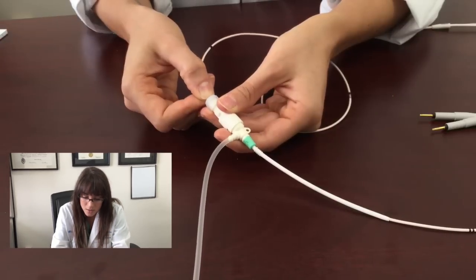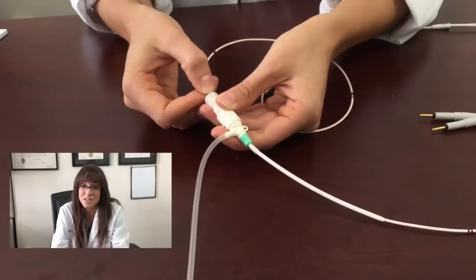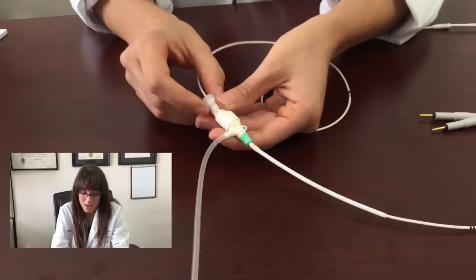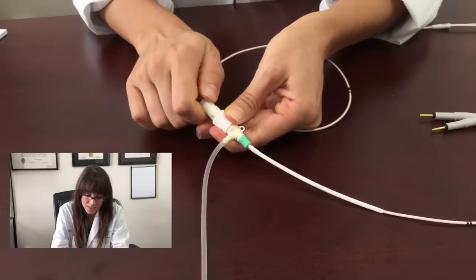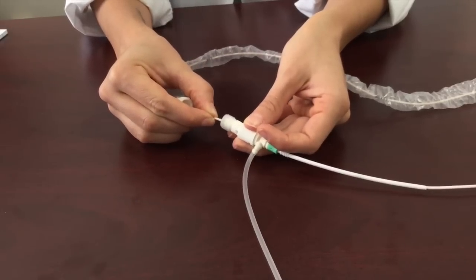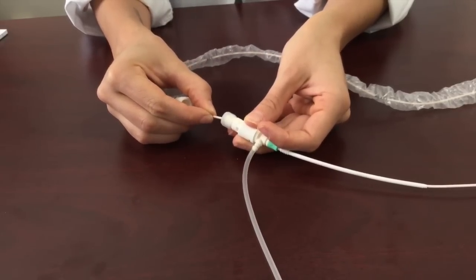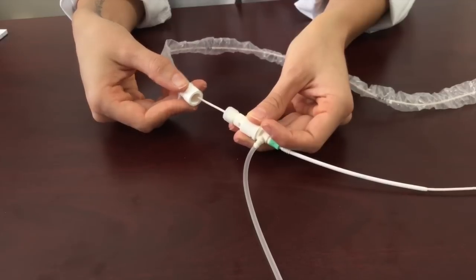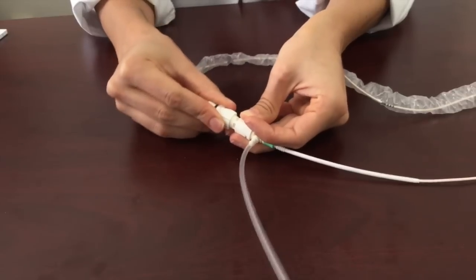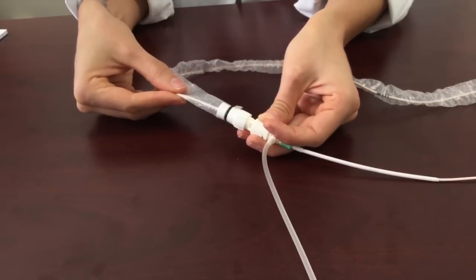Once you've got capture, the next step is to take the balloon down — your non-sterile assistant will deflate the balloon. You're actually going to advance the pacemaker wire just a few millimeters to ensure that the tip of the pacemaker is sitting nicely in the ventricle. Next we're going to cinch this tight, which is really important to ensure that your correctly placed pacemaker wire won't move. Finally, take the contamination shield, fully expand it, and place it over the clear adapter so that everything holds securely in place and your wire remains sterile.